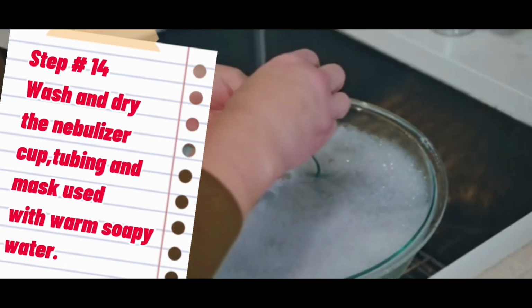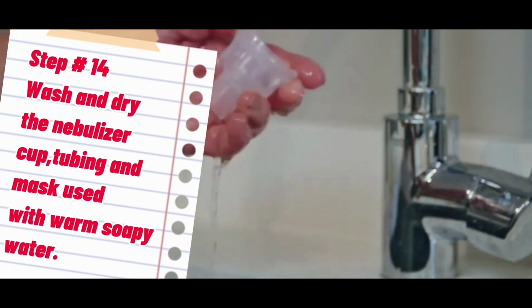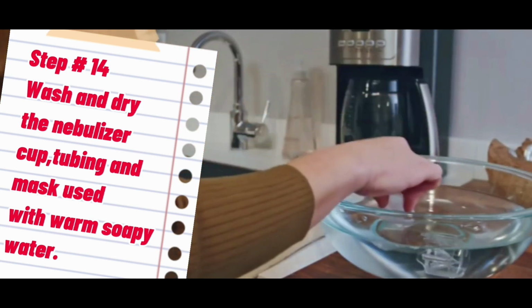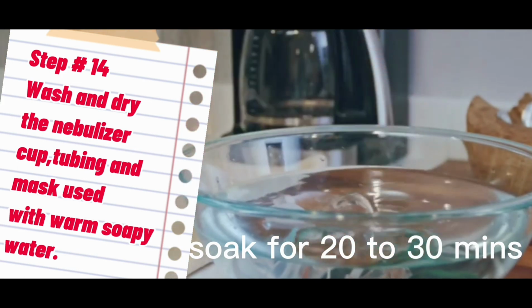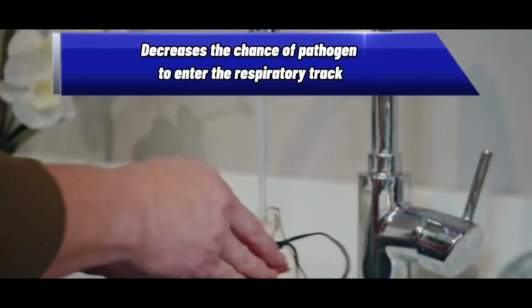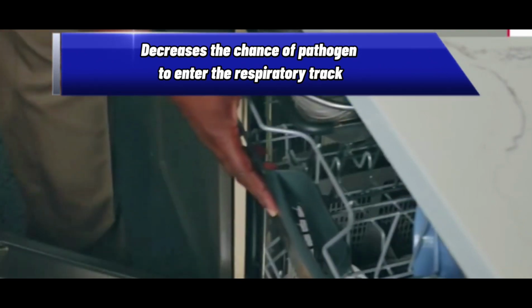Step number 14. Wash and dry the nebulizer cup, tubing, and mask used with warm soapy water. Then, it could be soaked with white vinegar and water. After that, rinse and dry. By doing this, it decreases the chance of pathogen to enter the respiratory tract.